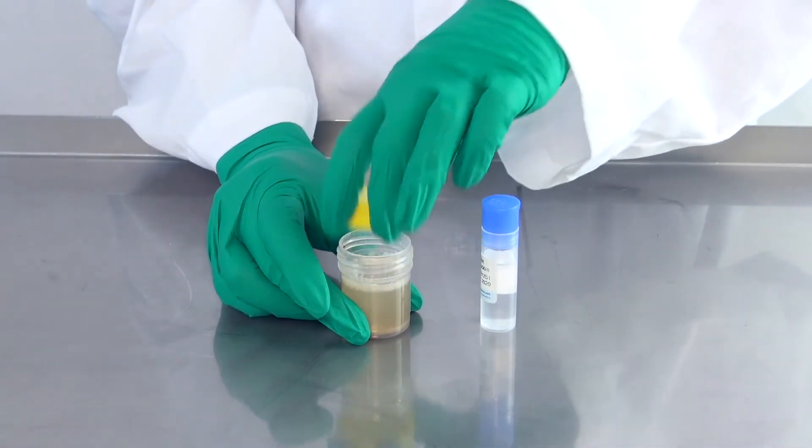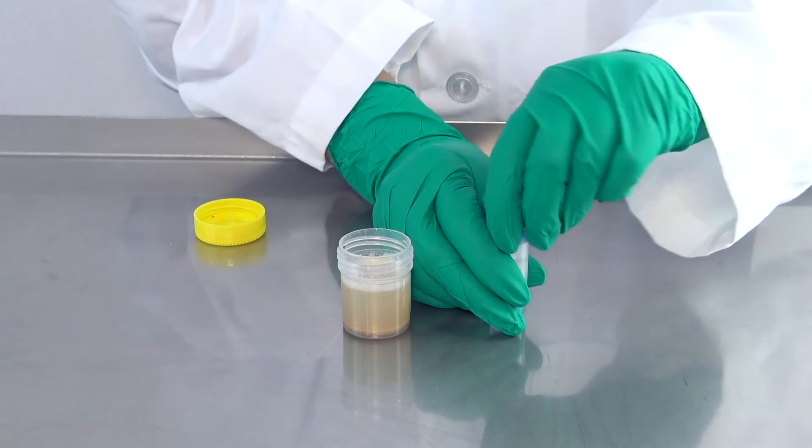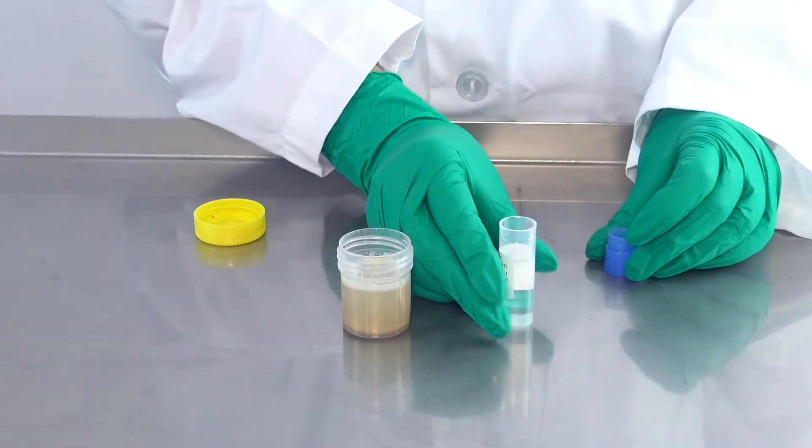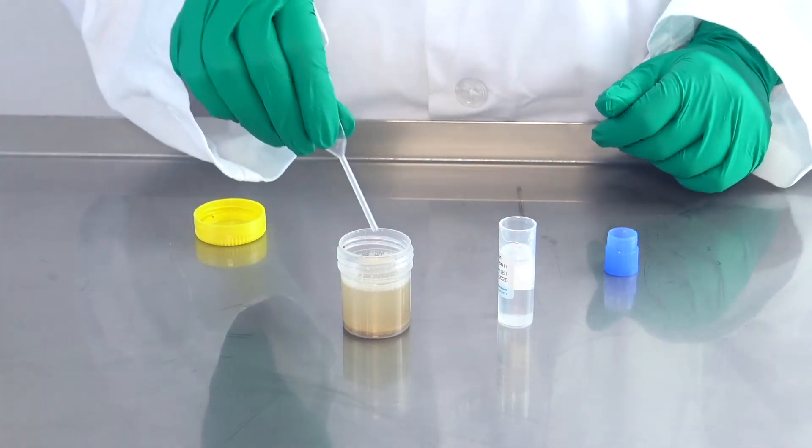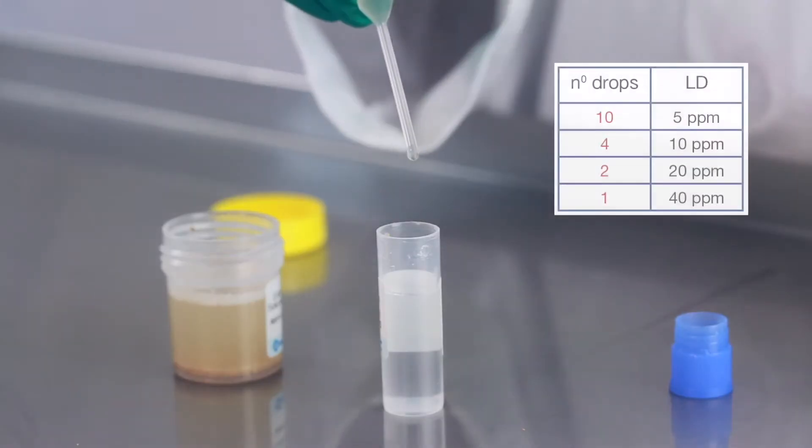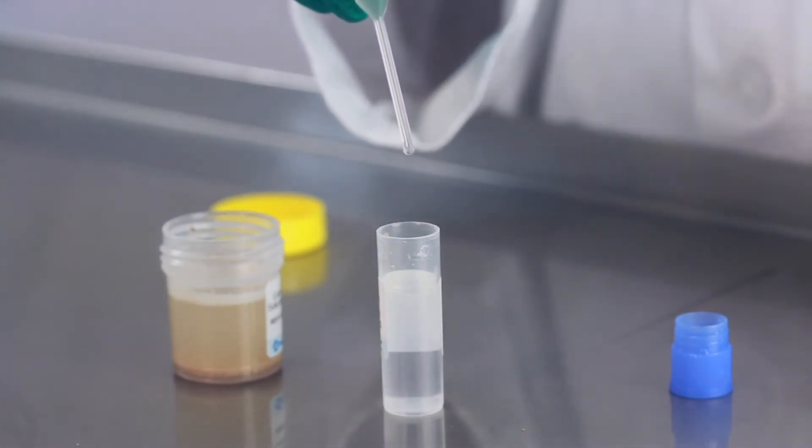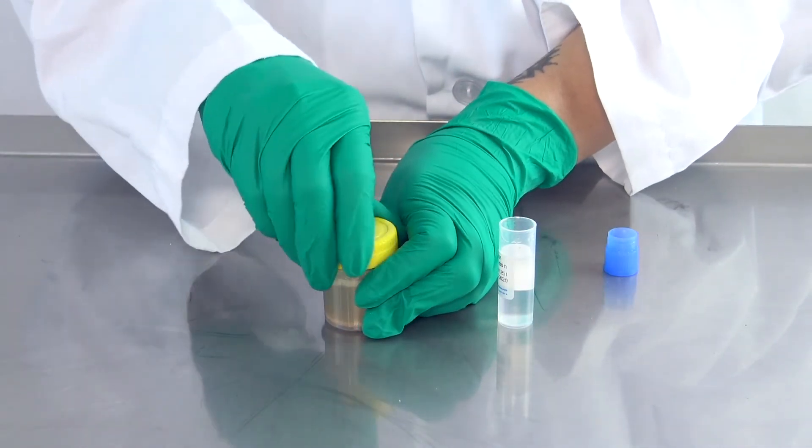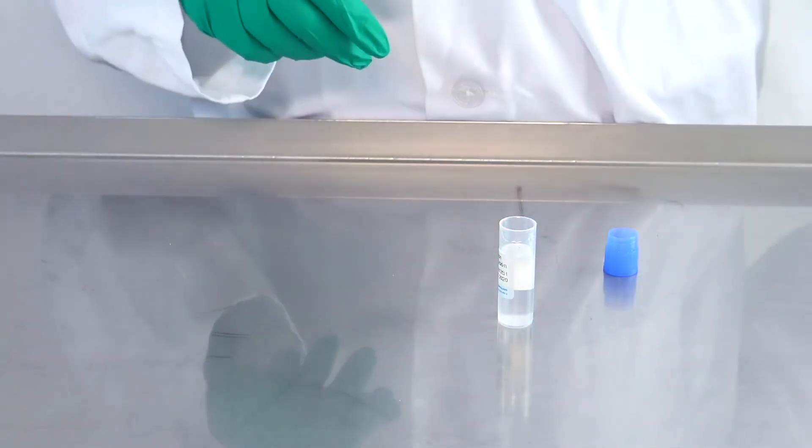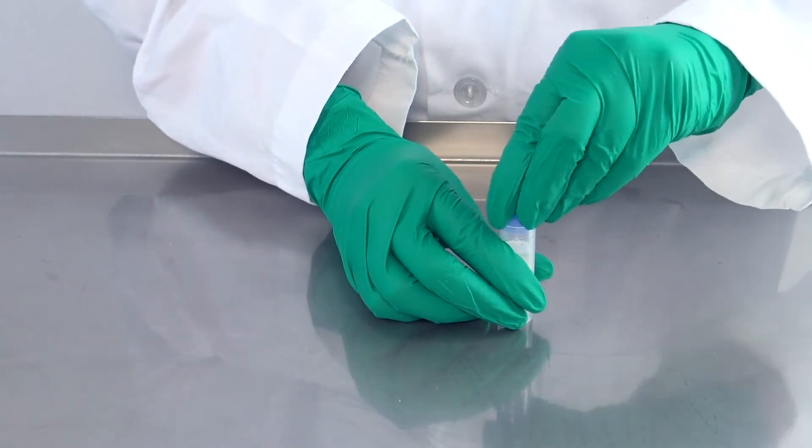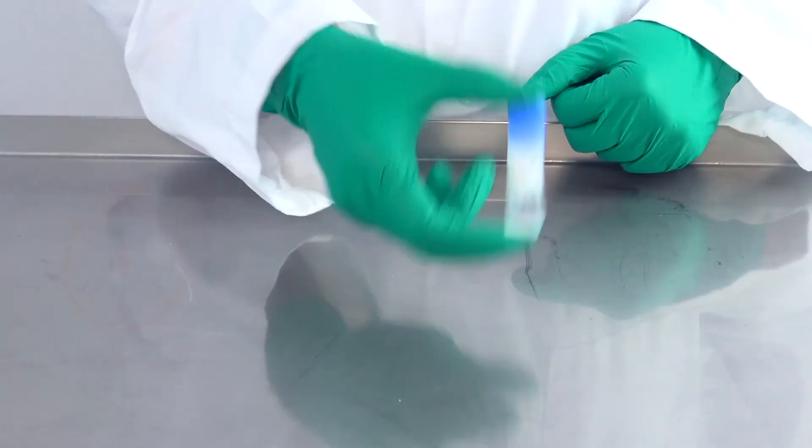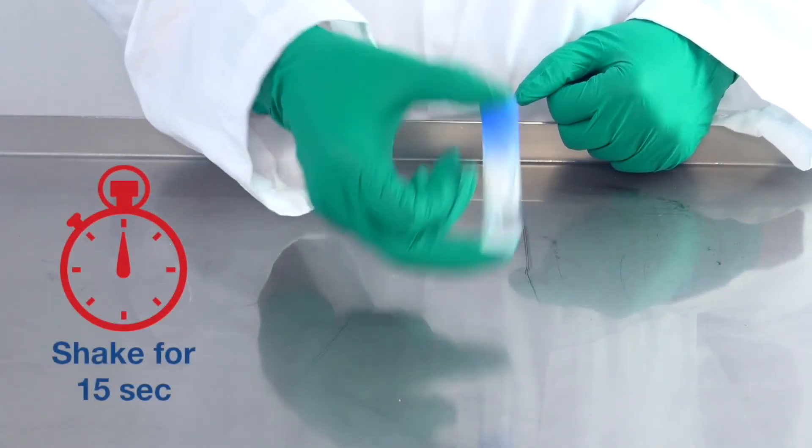Open the extraction bottle with the yellow cap and one dilution vial with the blue cap. Take a disposable plastic pipette and using the number of drops indicated on the manual, transfer the liquid from the extraction solution with the yellow cap to the dilution vial with the blue cap. Dispose of the used pipette. Mix softly for 15 seconds.